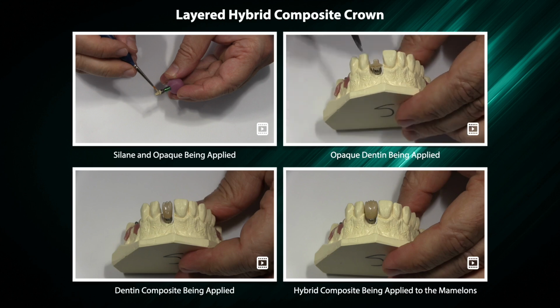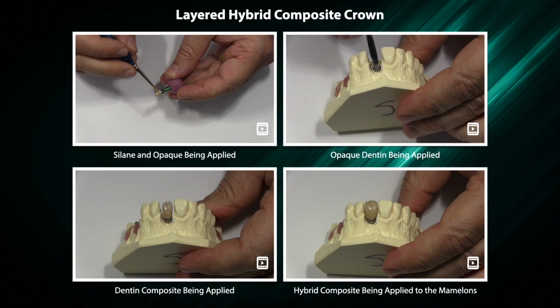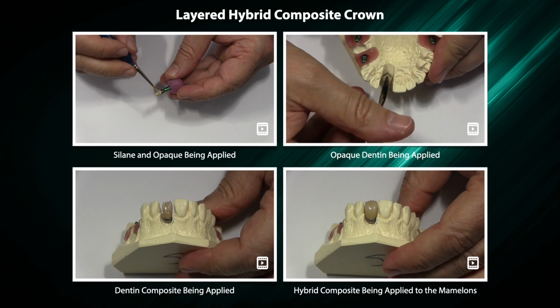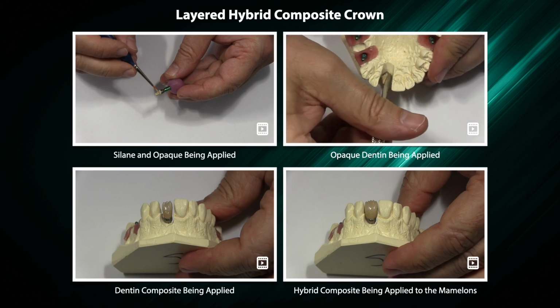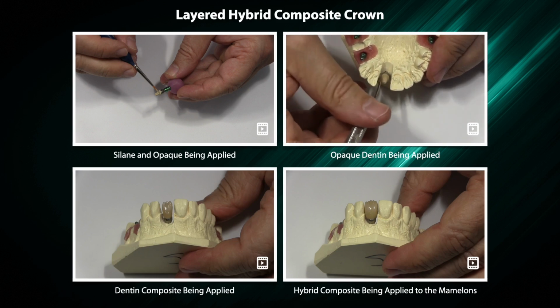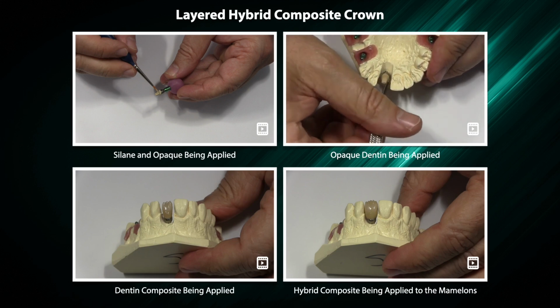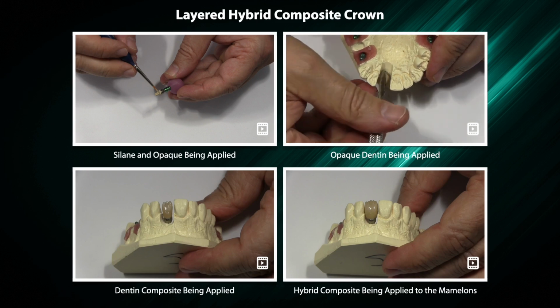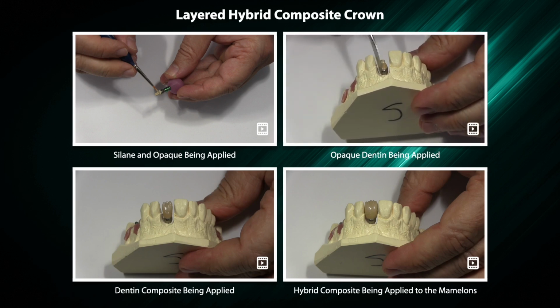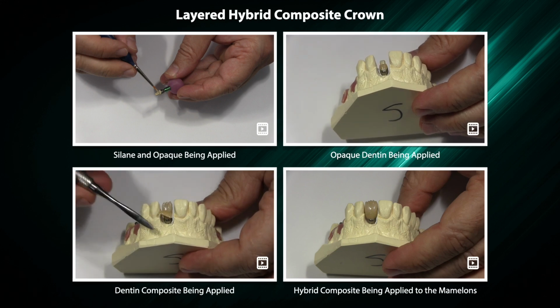Opaque dentin being applied. Dentin composite being applied.